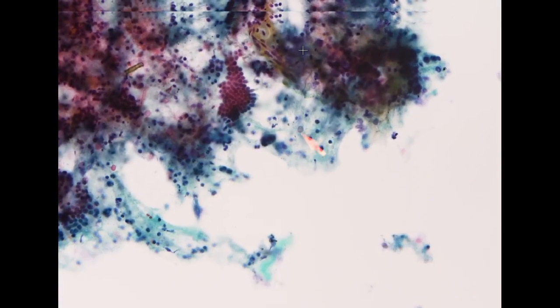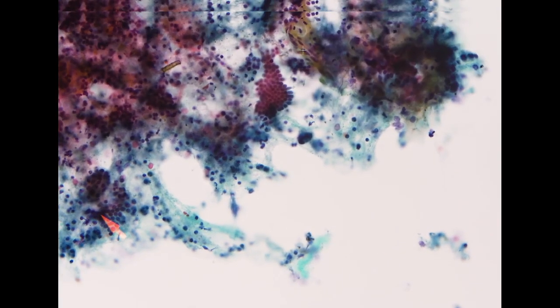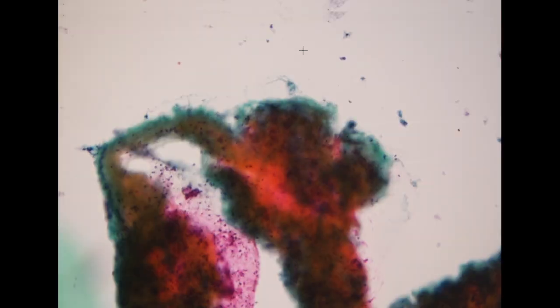Here most of the epithelial clusters look nicely arranged with a honeycombing pattern. These all look normal, but the background is a little bit abnormal because it's highly degenerated. In this type of highly degenerated specimen, we need to identify unequivocal cells that we can definitely call positive, just like what we see in the prior specimen.